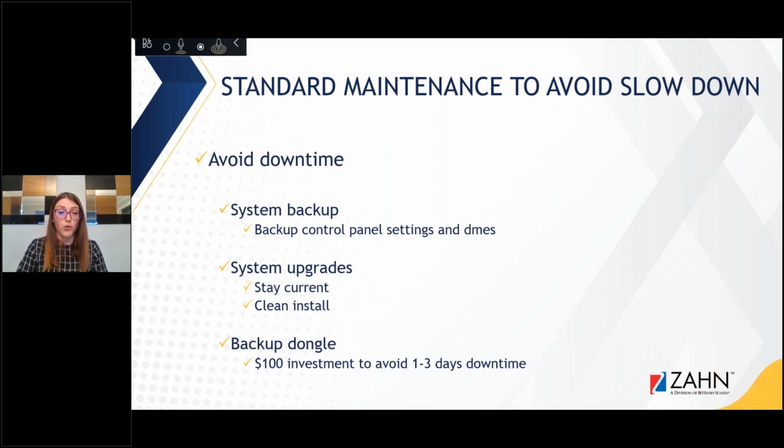Majority of them can. You can import directly from there, so you don't even need to reach out to manufacturers anymore. But it's definitely improving the performance of your 3Shape software. So probably at least every 5 years, I would say do a clean install. If you can afford to do it every 3, that's perfect too.